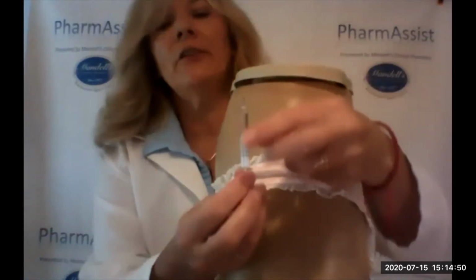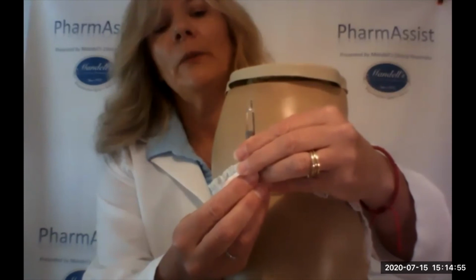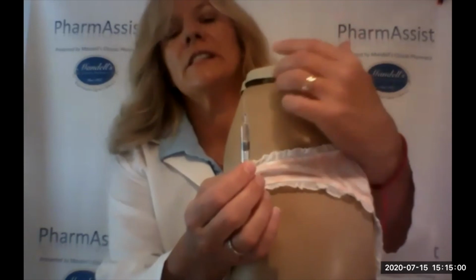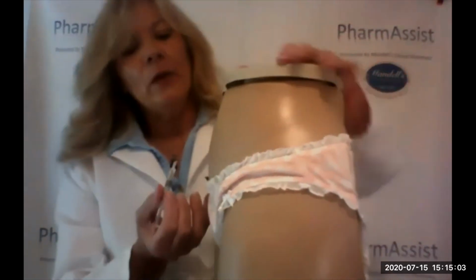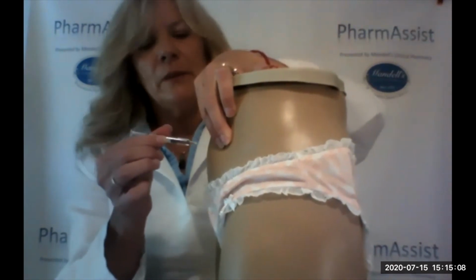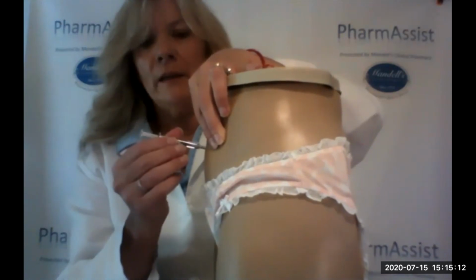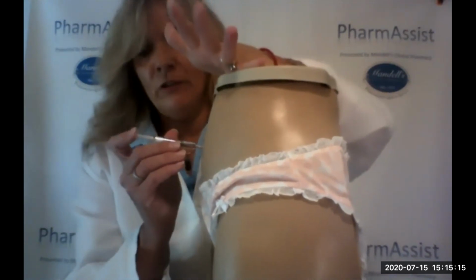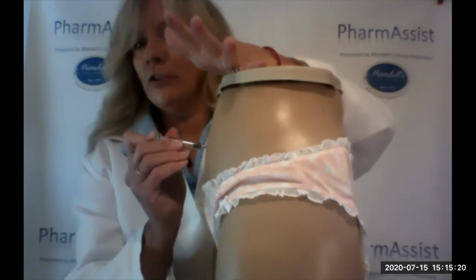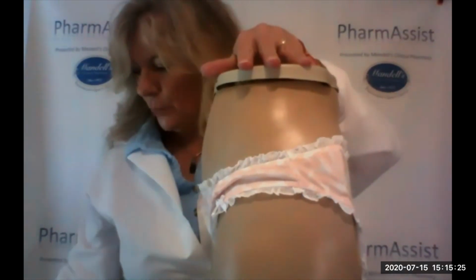Here's where I said that if you do a gentle little push-up with the liquid, you want to gently push that up and create a little bubble or a little release of liquid, and that's fine. Then we pinch the skin in this belly, and we don't have to jab. Place the needle gently to the skin, insert the needle all the way, let go of the fatty pinch, push the medicine all the way in, count to 1, 2, 3, and then release and take out that syringe. And you can put a little cotton ball there.